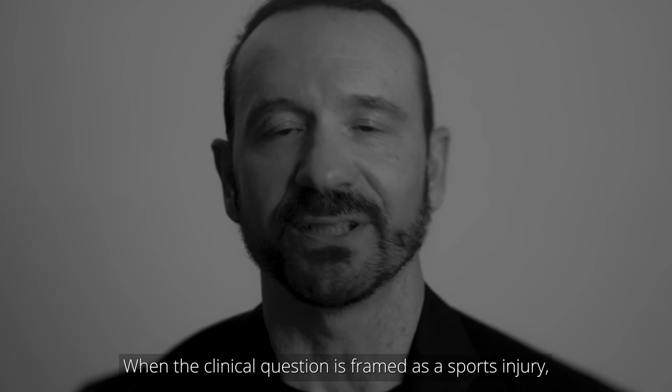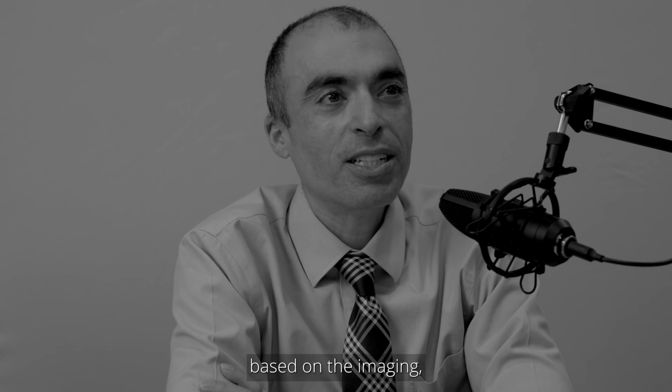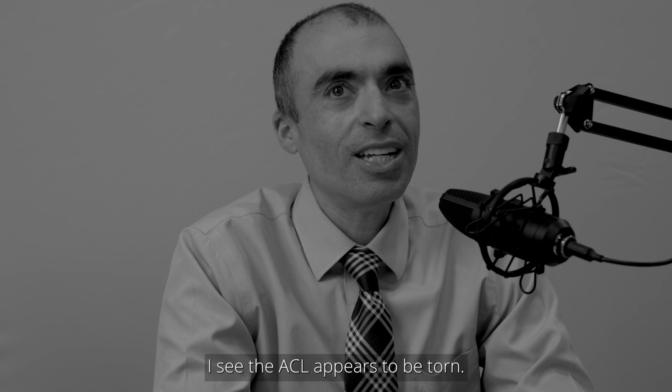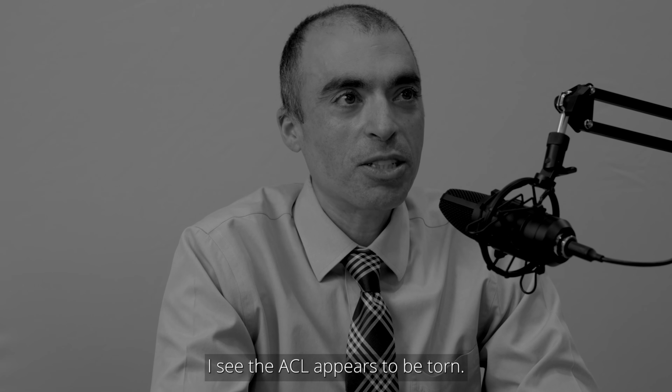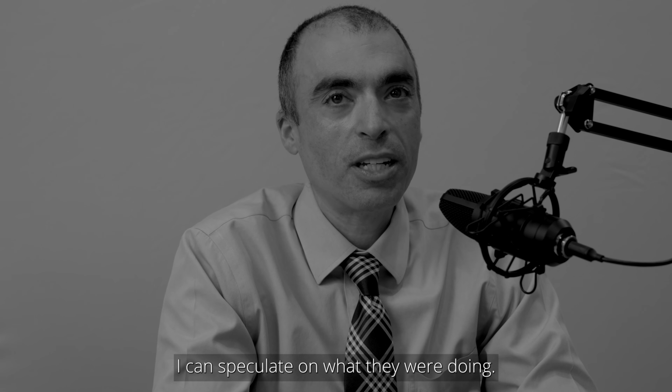When the clinical question is framed as a sports injury, what makes TGCT easy to overlook on imaging? While we as radiologists commonly are able to figure out the history based on the imaging, meaning that, oh, I see the ACL appears to be torn, or I see findings that suggest patellar dislocation, I can speculate on what they were doing.